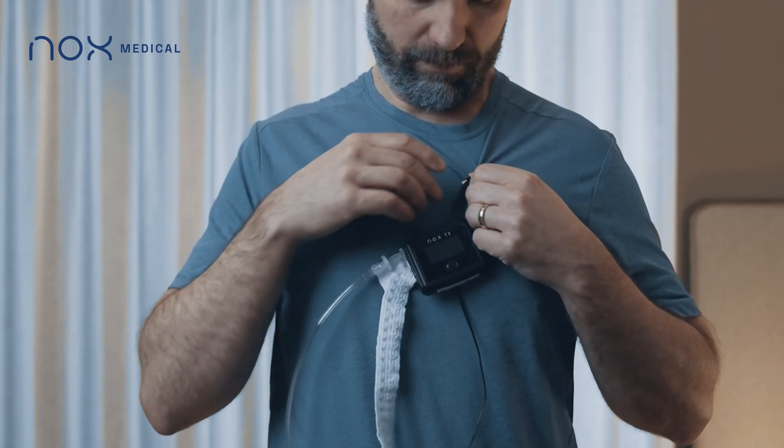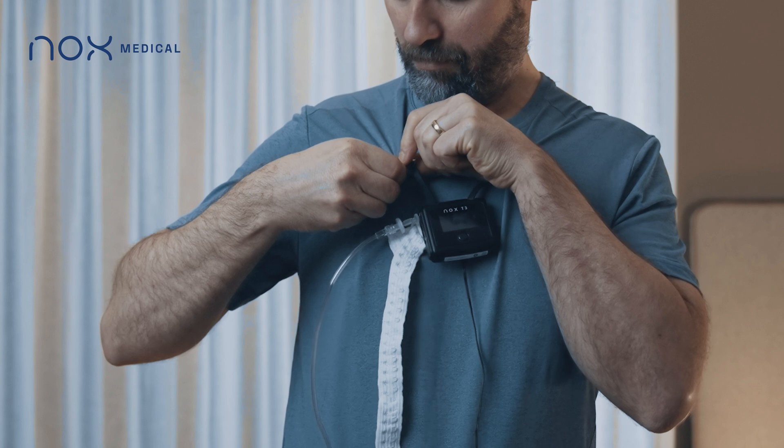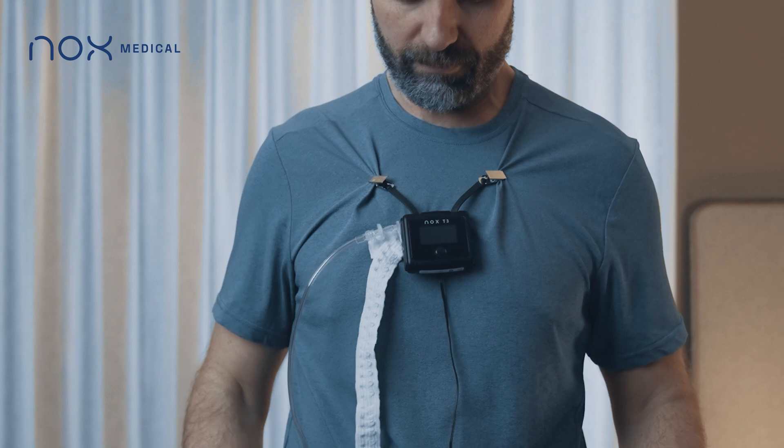Snap the two clips of the T3 device close to the collar of your t-shirt, so the T3 device sits on top of the chest. Make sure the device display faces forward.